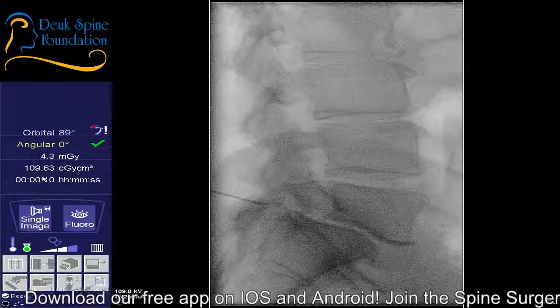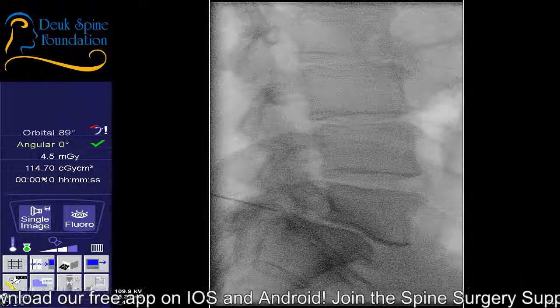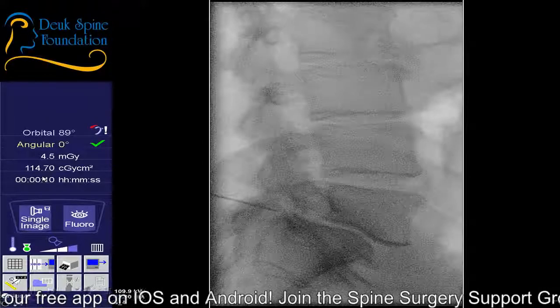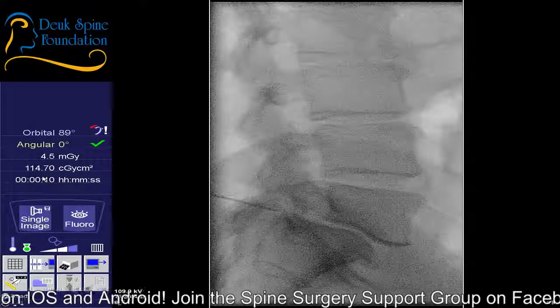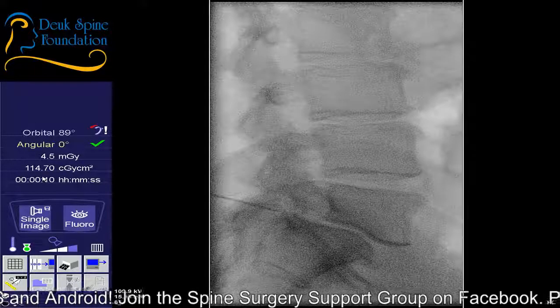And we're encountering really a tremendous amount of scar tissue. Is that it? Yes, sir. From the fracture. How long ago did your back start hurting you?